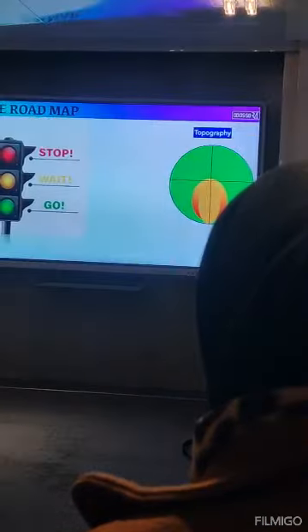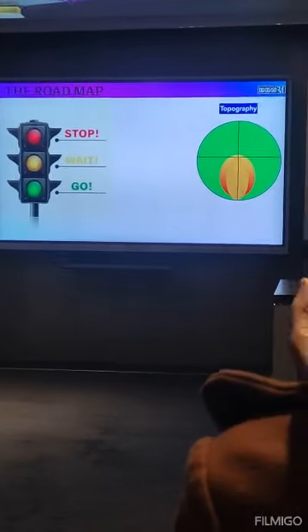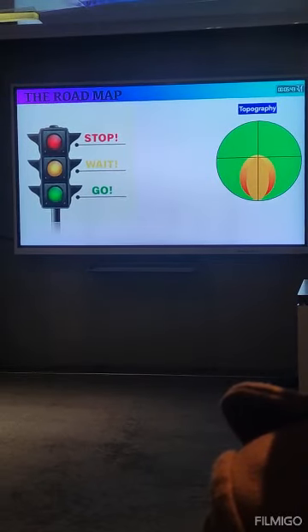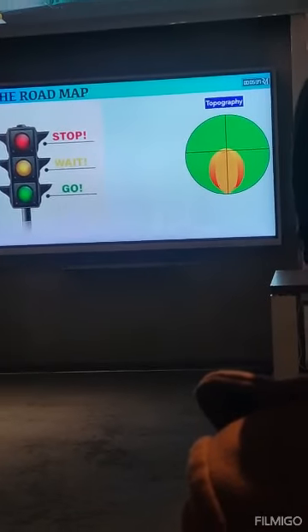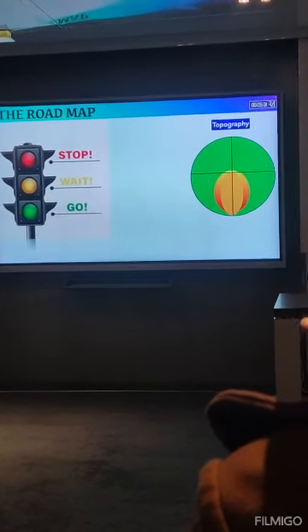Let's continue also the roadmap. The previous scan with a different tomographer. Did it show normal in the other tomographer? No, I did this patient on the Pentacam and on the MS39. Regardless of the epithelial map, which was very indicative, the keratoconus indices of the MS39, what did they say?